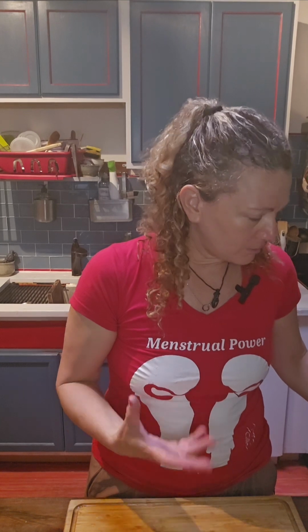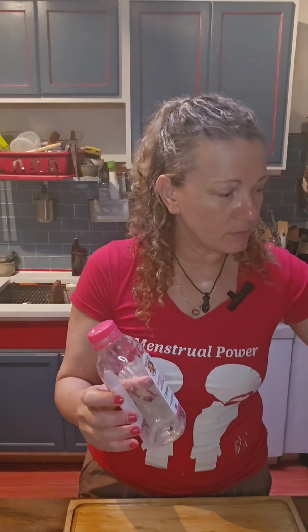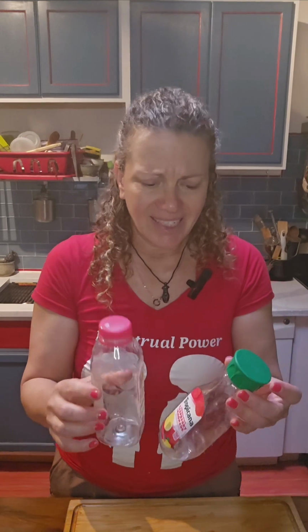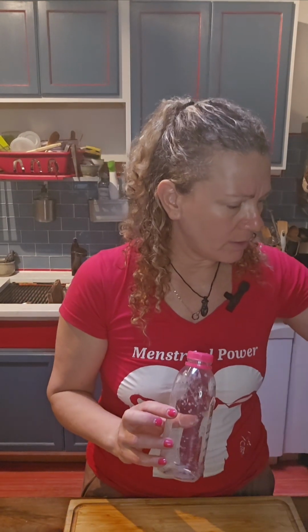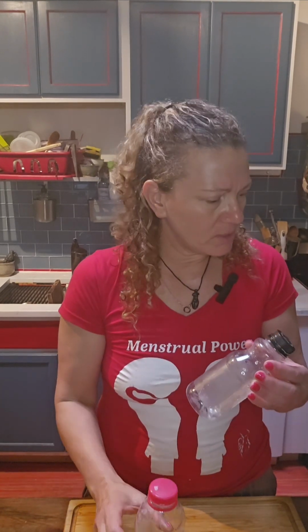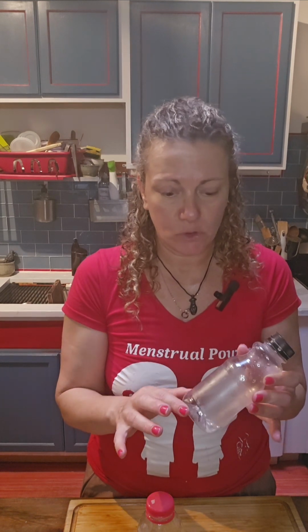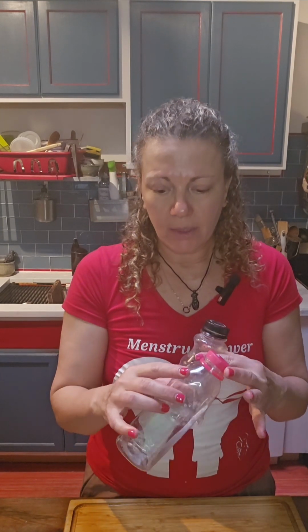So in order to make a Syngina model or vaginal model, you start at the grocery shop, and here I bought a few bottles. Anything can go, the little ones. Everyone is good as long as you can see that the surface is smooth and it can be seen through the plastic. And there are two kinds of labels.